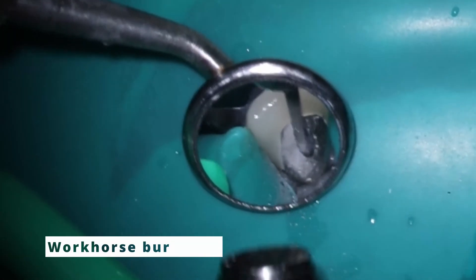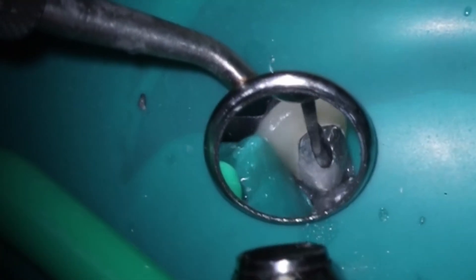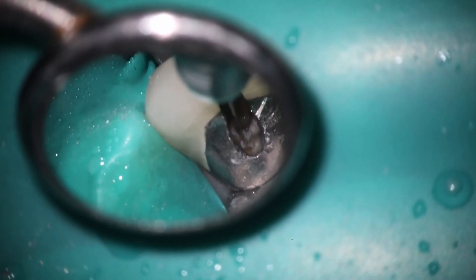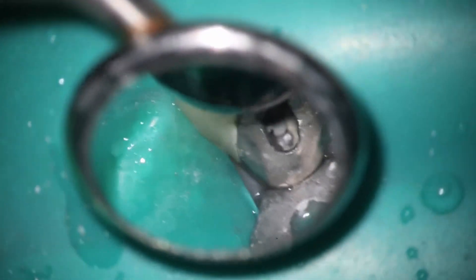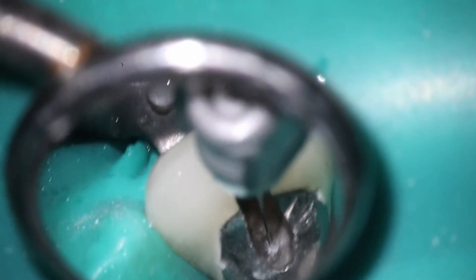So the first thing we're going to do is just the access — I'm going to take the workhorse bur up right into the incisal edge. I think the reason we used to have issues with this is because with old school PFMs, the lighter porcelain or porcelain jacketed crowns would actually fracture. With modern materials like Emax and Zirconia, it's much stronger and you don't need to do that. What you're seeing here is they hadn't even actually gotten down into the canal space, so I had to access apically. They almost went out the buccal but were not actually in the canal apically, and as you can see we're starting to drop down using the 8C and still not even in the canal.